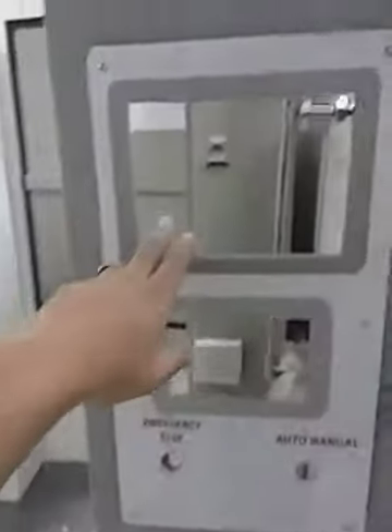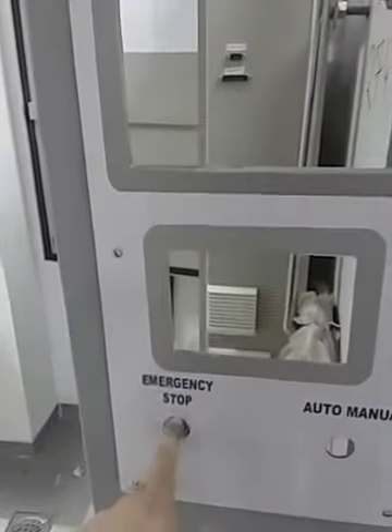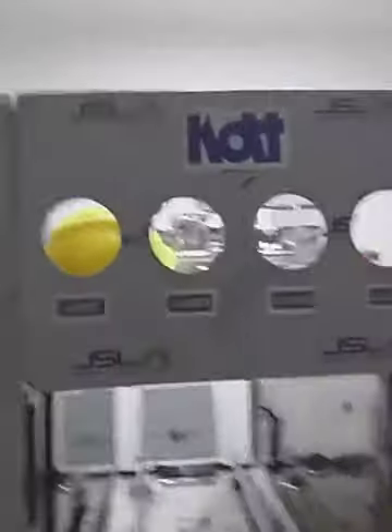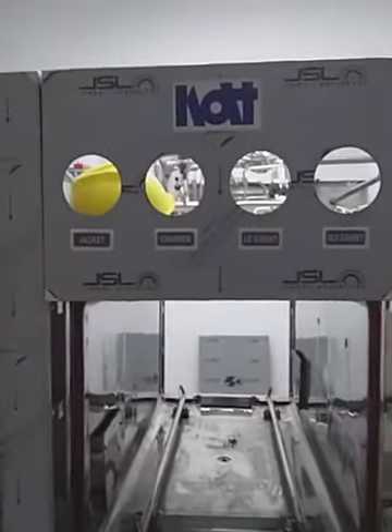This is the boiler. So here I will connect the human machine interface. Here I will connect one controller. Here I will connect the emergency stop and auto manual. And here I will connect some gauges — four gauges I have to connect. I will connect after lunch.